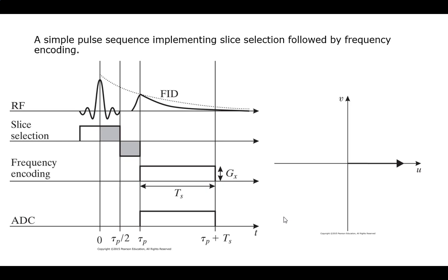And basically, if I look at what that does in terms of my K-space plane, notice that causes this to happen. In essence, I move from the origin in K-space straight down the U-axis. This is my X direction, that's my Y. Notice I didn't give any Y perturbation. Since I gave no Y perturbation, you stayed at the origin. That's why this is such a simple one.